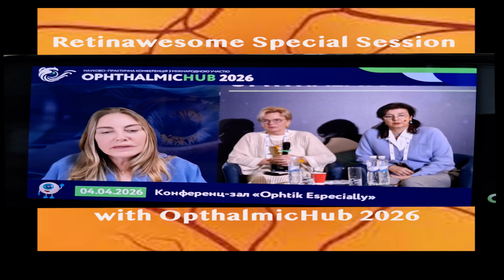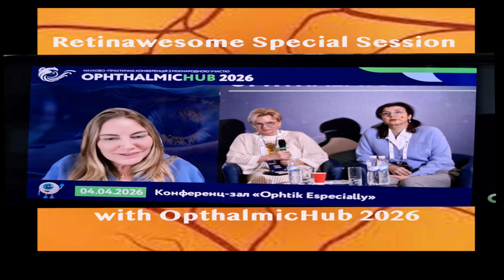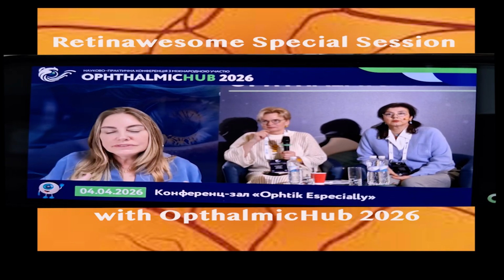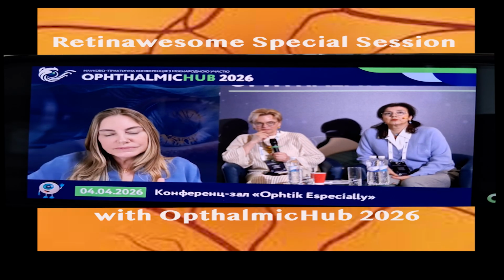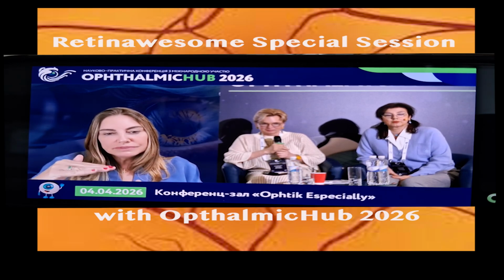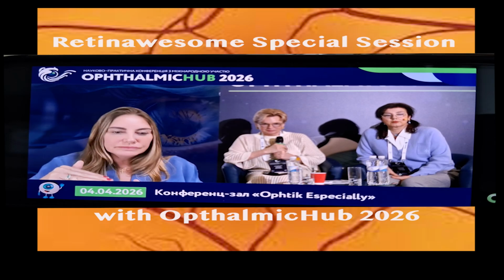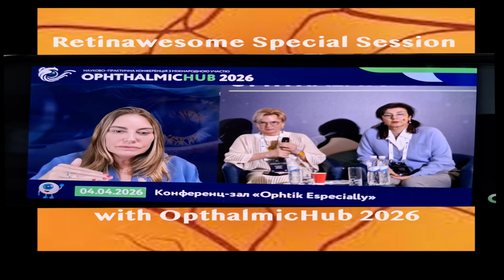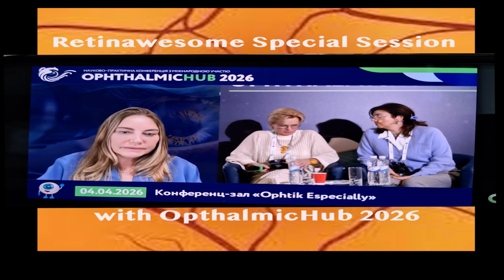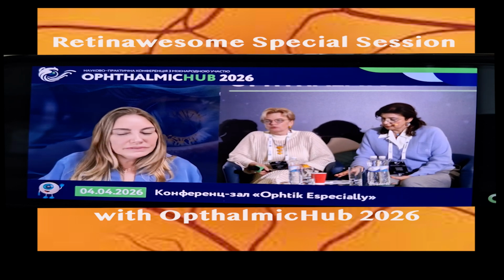And sometimes, I don't know if I answer you well, during the surgery, you put the buckle and then you check with the chandelier to see if it's in the right position. What I do is a little movement. You need to not be so aggressive, because you can have, for instance, choroidal hemorrhage.